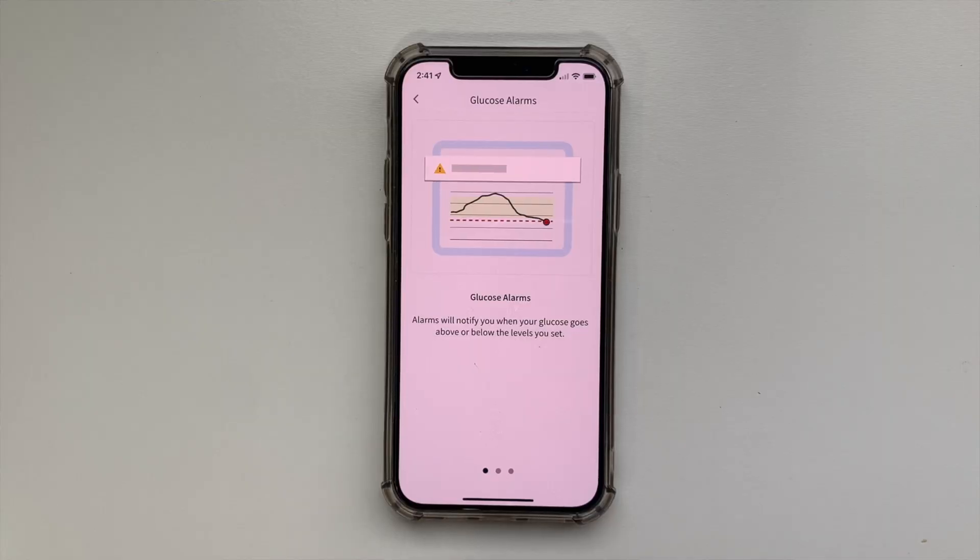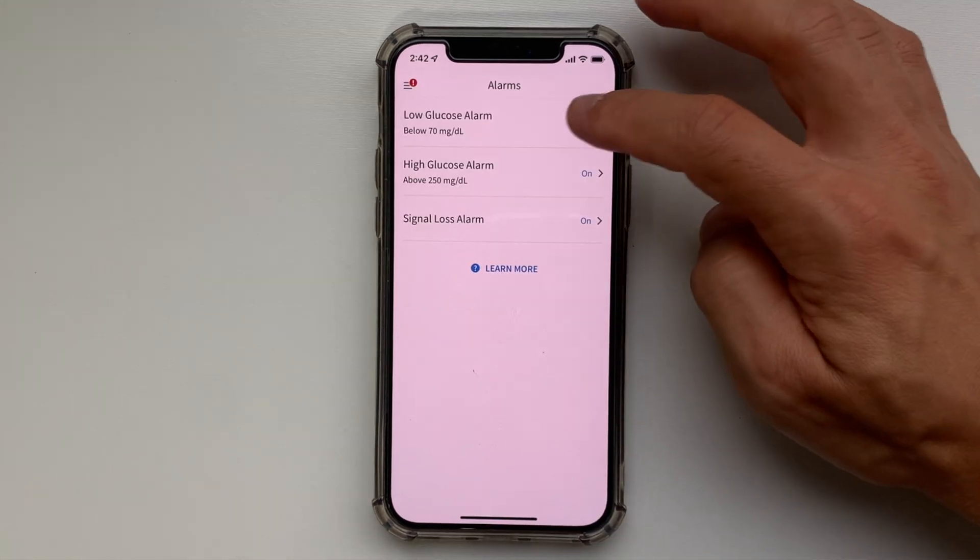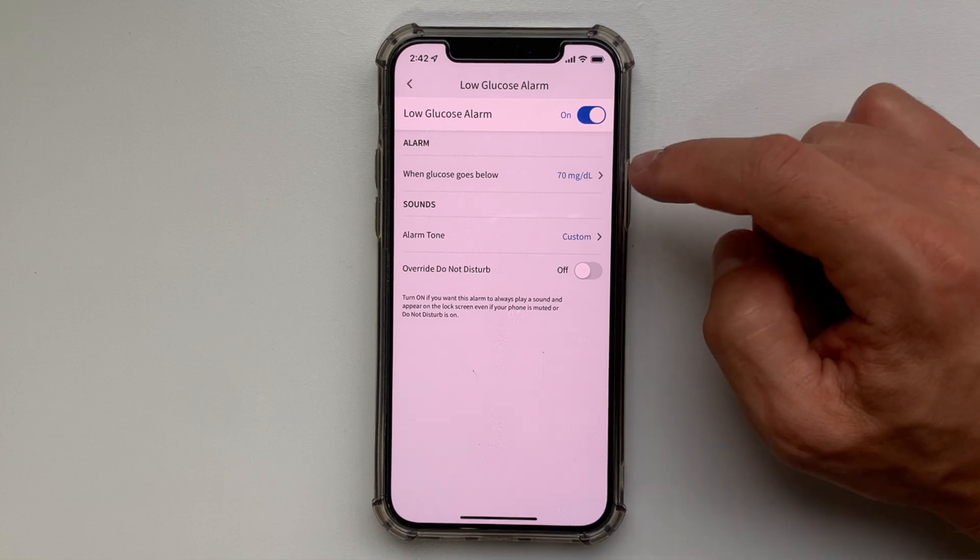Now we're still in the 60-minute warm-up period, so let's set the alarms and the target glucose range. Alarms can be set in the alarms section, and you may need to configure phone settings and allow permission for the Freestyle Libre 3 app to receive alarms.